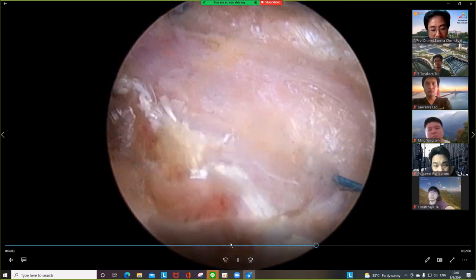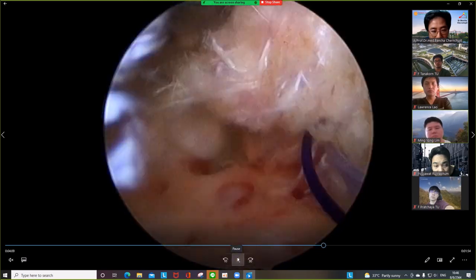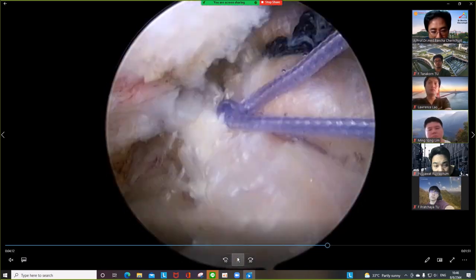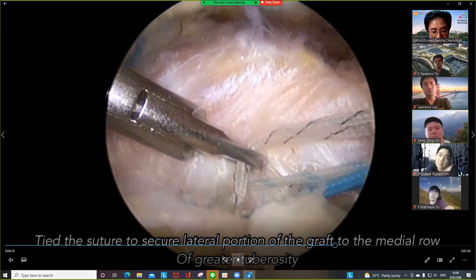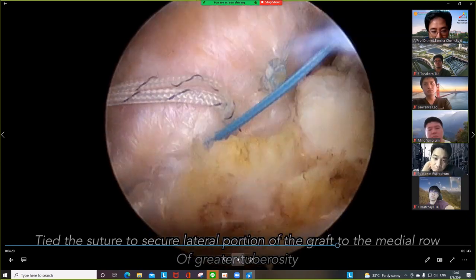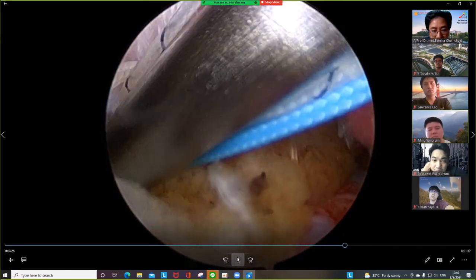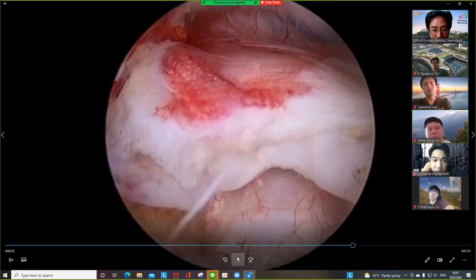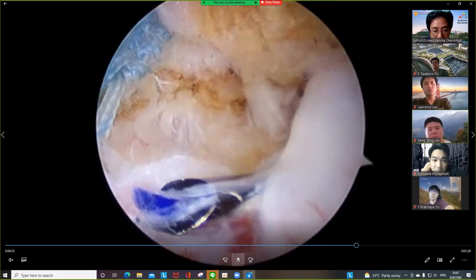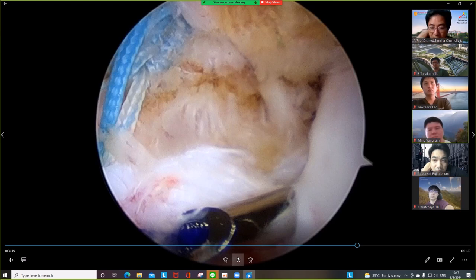After you manage your sutures, make a side-to-side repair. This is the first side-to-side — the graft is already spread. Tie the knot one by one. This is the side-to-side for the distal part. Tie the knot over the tuberosity. It's now like doing a rotator cuff repair, but the benefit is that you have less tension — the graft is just placed over the defect without tension, so you have less chance of failure.